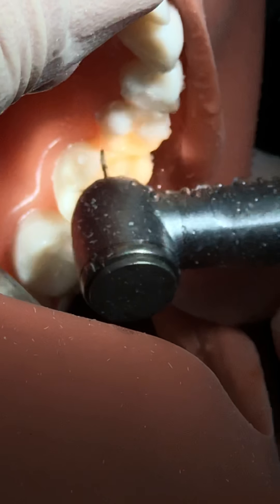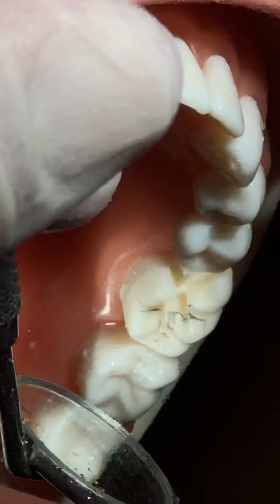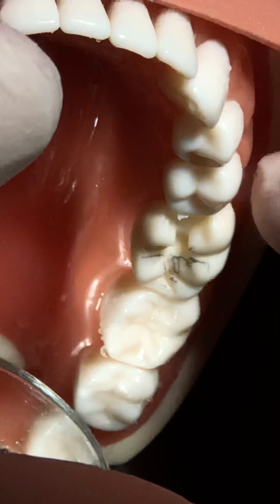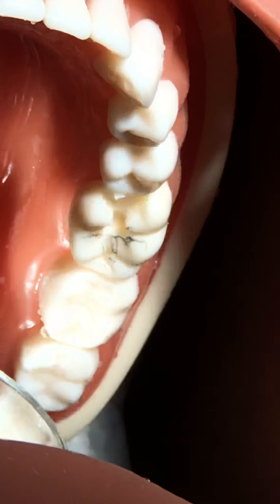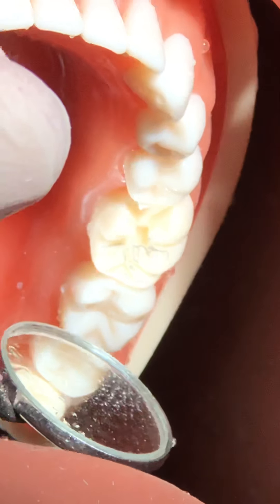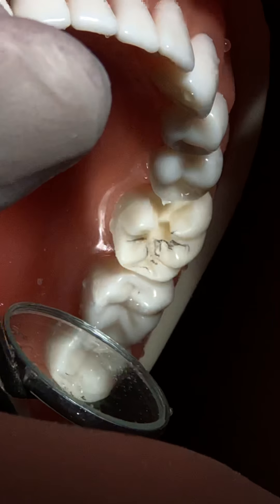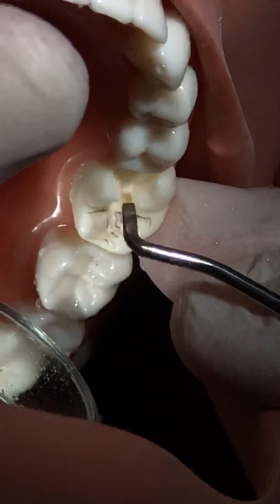You can use a small band - place a band and a wedge. The advantage of the wedge is it creates space and the band protects the proximal tooth. This is indicated in this case, but for beginners you should first learn to conserve the tooth using just your natural sight without any aid.